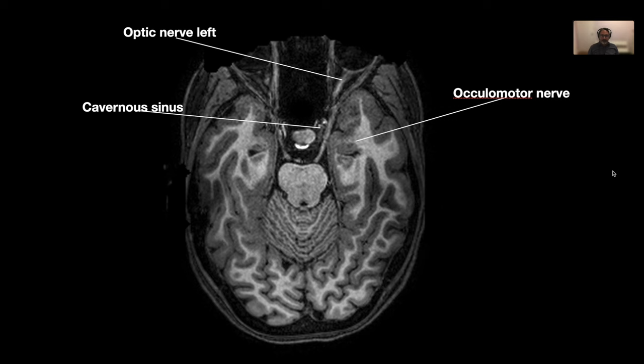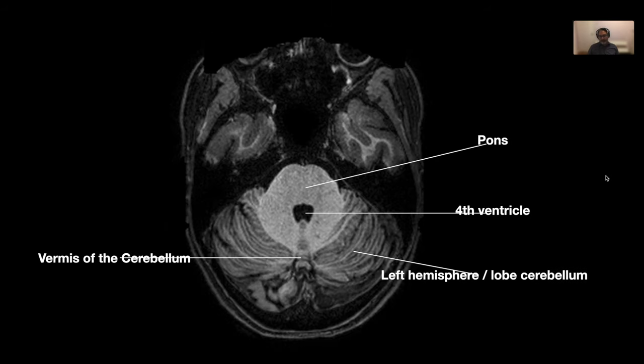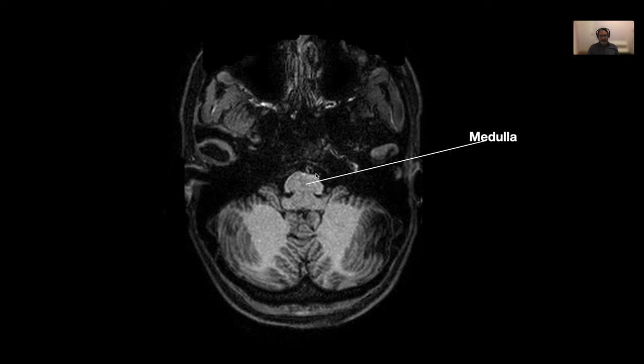I'm surprised I didn't. And I'm not sure if I can see it here or not, but it would be there. And no, but now it's a bit too high. Now the basilar artery will join the circle of Willis here. So the basilar artery is important to see in all your views. And I should have mentioned that. You cannot miss it.